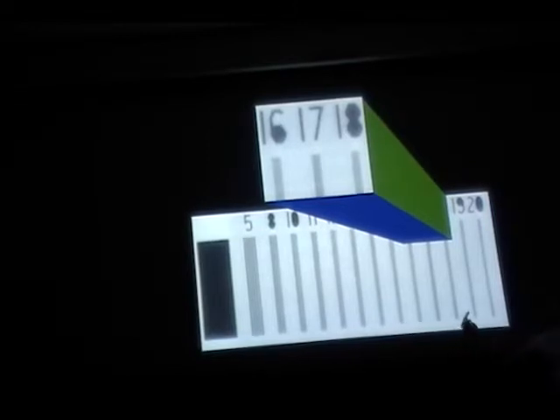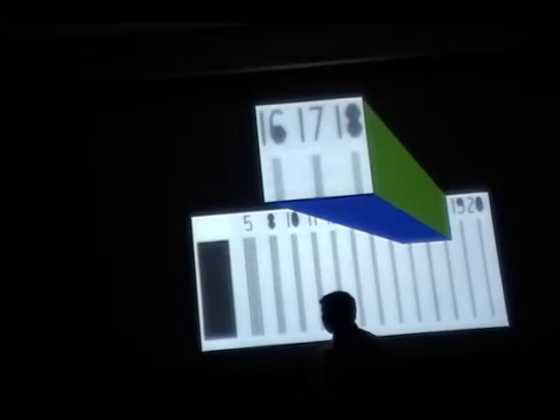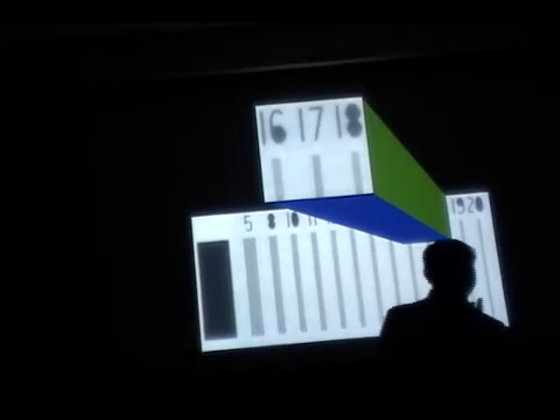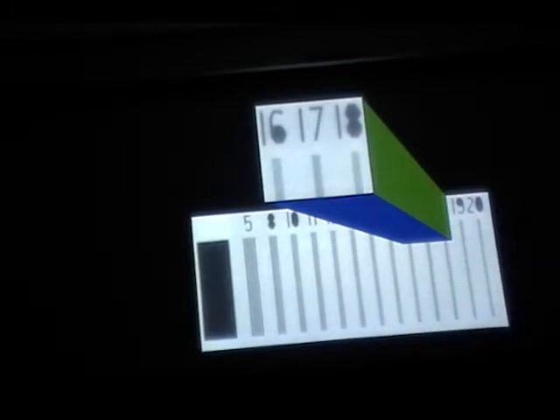You might be asking this question, right? Why the hell I'm teaching you this? Because how many of you are going to own your dental offices? Quite a few here, right? So that means as a dentist, every year you have to do this calibration of your X-ray units. This is what you check for.